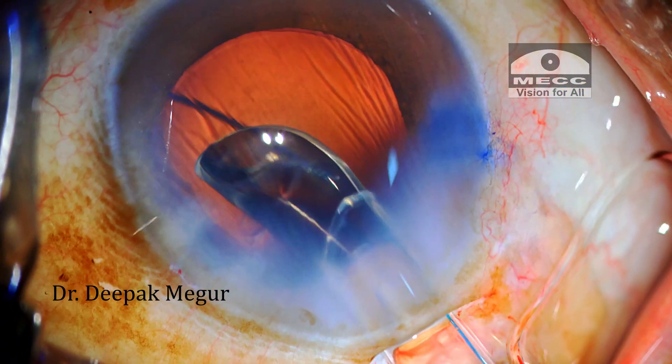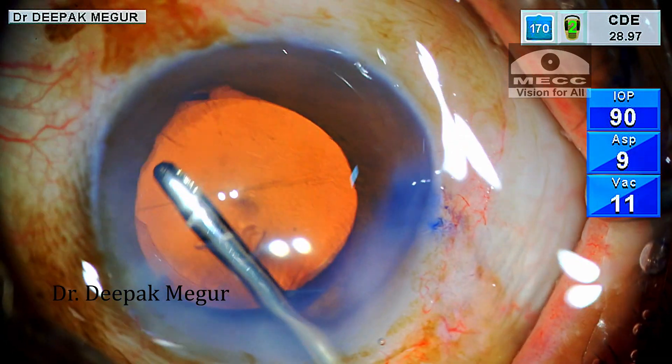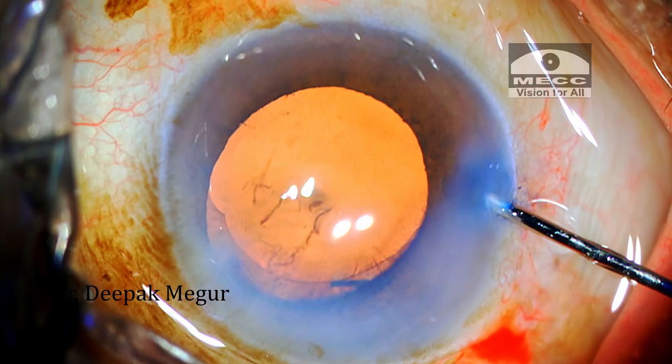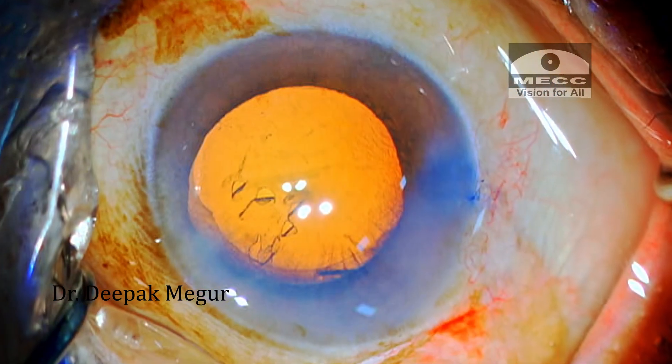The lens is being placed into the bag now. That's it — the case is done. I hope you found this helpful. Thank you so much for watching.